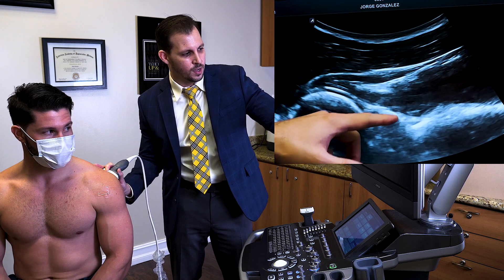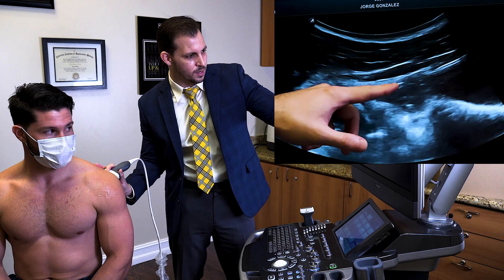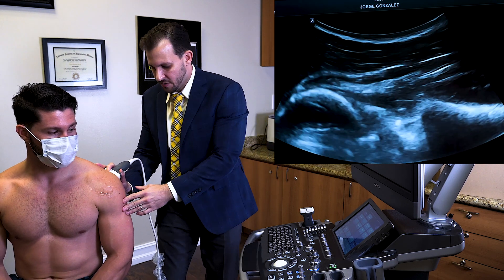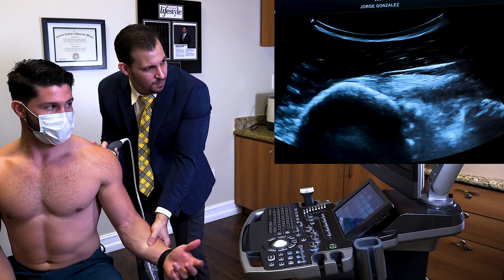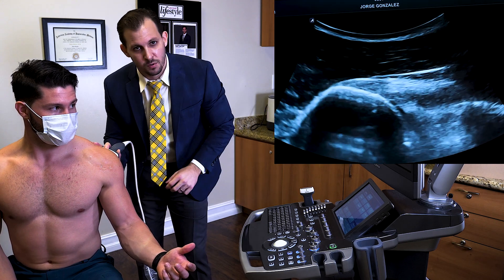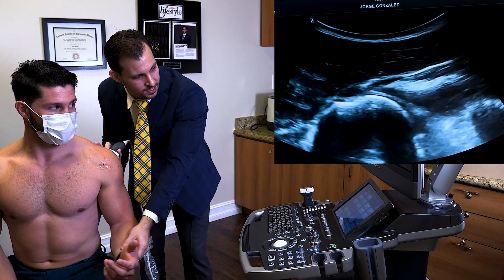At this point we could actually see the glenoid and a portion of the labrum. The infraspinatus tendons are going to be right in here. One easy thing you could do to help identify the structures is to get the patient's hand and externally and internally rotate. At this level we could actually see the infraspinatus a little bit better — a nice fibrillar structure, just like any other tendon.